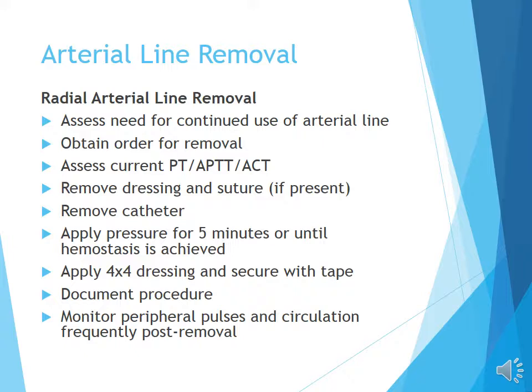So what you want to watch for after you remove it is bleeding, hematomas, again, those neurovascular checks, check their peripheral circulation. If they have a loss of pulse, that could be an emergency. So make sure you're watching those pulses, circulation frequently post-removal.